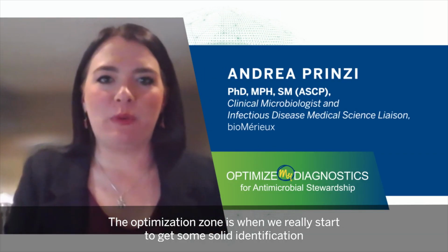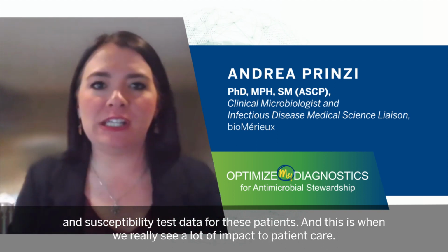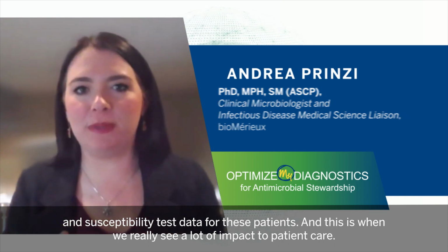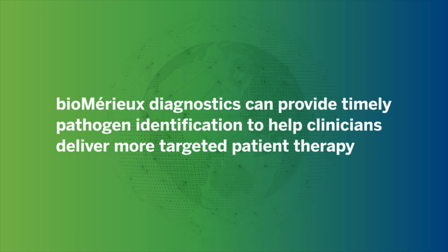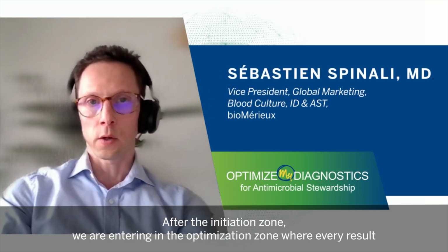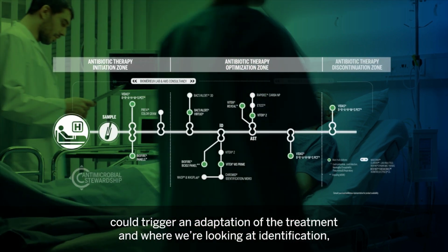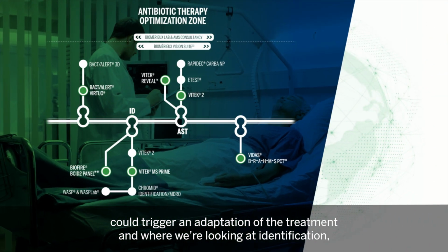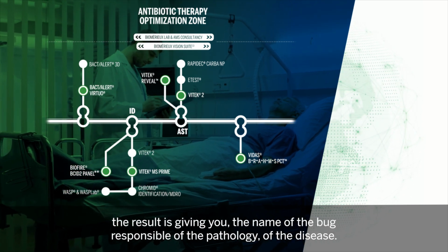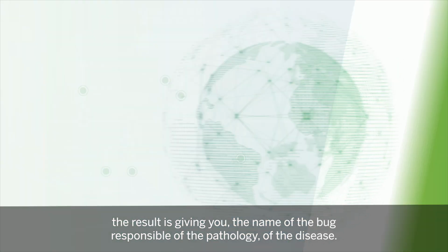The optimization zone is when we really start to get some solid identification and susceptibility test data for these patients. And this is when we really see a lot of impact to patient care. After the initiation zone, we are entering the optimization zone, where every result could trigger an adaptation of the treatment, and where we are looking at identification. The result is giving you the name of the bug responsible for the pathology of the disease.